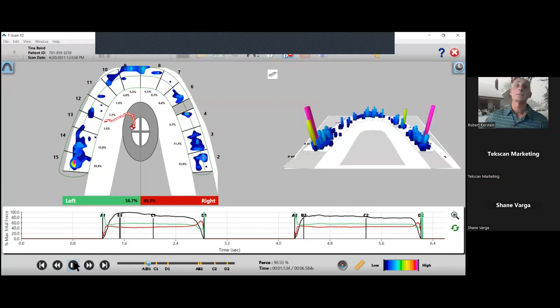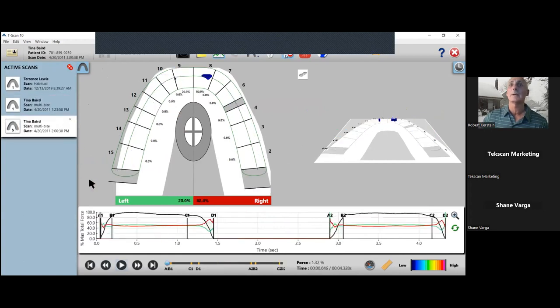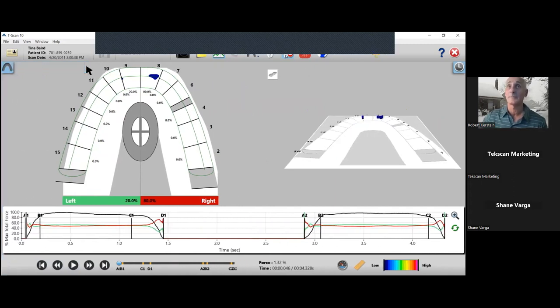Right, so all I had to do is go in and treat that occlusion, that one contact. I didn't treat anything else. People always ask me, well, why didn't you treat 15? The answer is, when you treat someone who has a problem-focused issue, a single tooth they can't bite on, a pain that could be from an abscess, it could be from a cracked tooth, you have to address that single tooth. And the thing that does for you as a clinician is it wins their confidence.